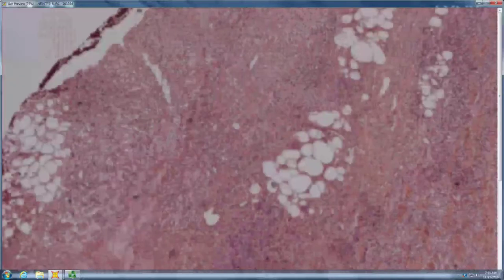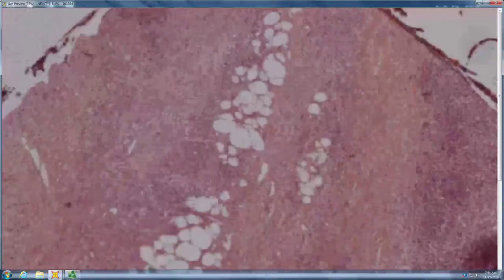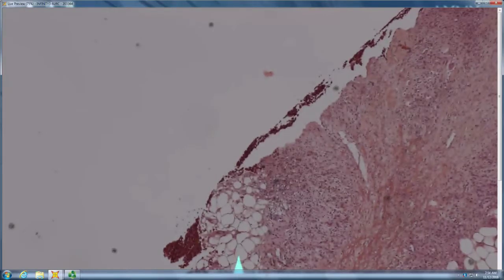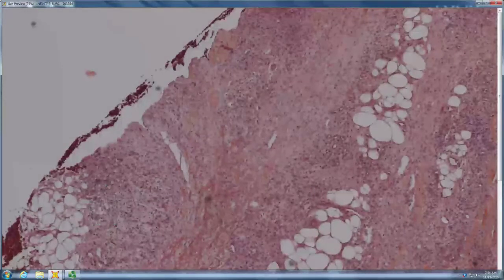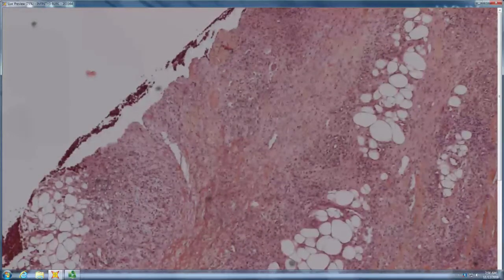It's a pretty squared off chunk. I don't see epi. There's a big vessel down there. Fat doesn't look too happy. It looks like whatever it's doing is surrounding the fat. So is the fat itself particularly necrotic, or not so much? Not as much as I would think. And yet, what would be all of this that was between the fat? Probably septae. Septae, chronic, which are granulomatous, like a chronic granulomatous with granulation tissue in the septae.